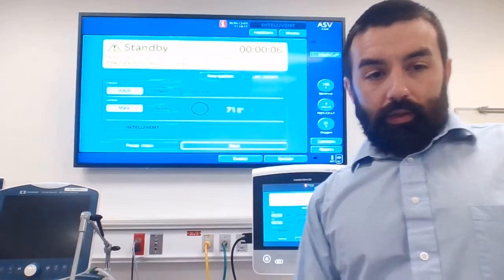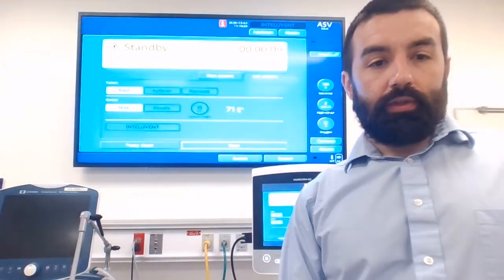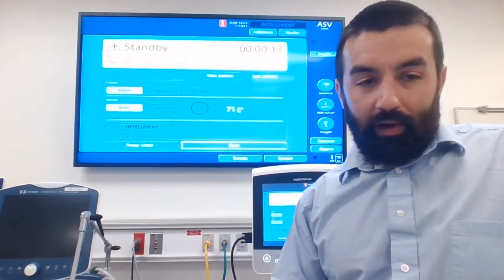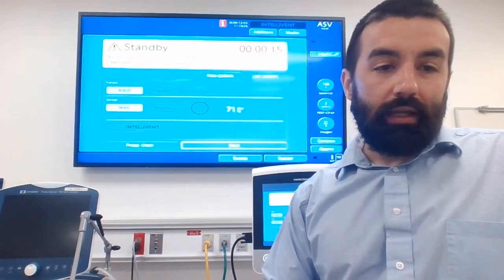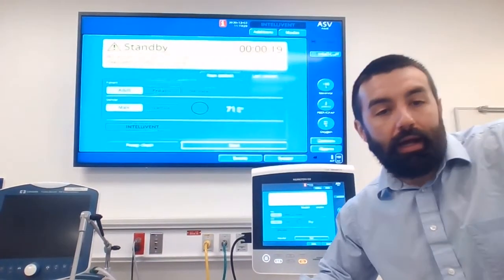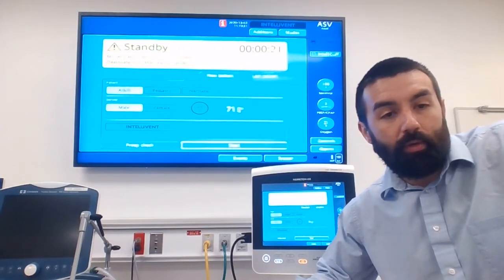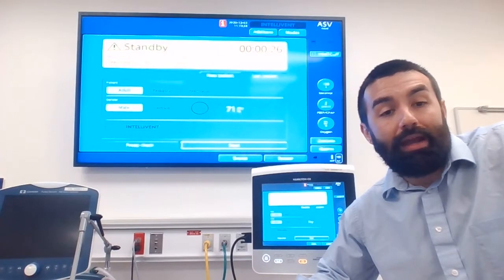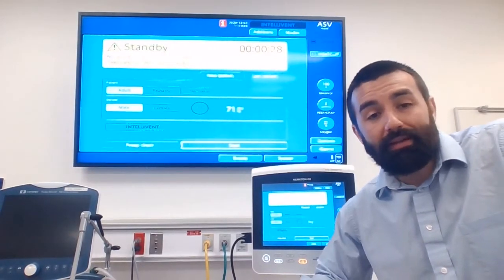Hey guys, so today I'm going to introduce to you volume support. So we talked about it a little bit. It's really like PRVC for a spontaneous breathing patient. It's important, even though we're not using it a whole lot on adults here locally. It is important to understand what volume support is if you're going to work more with kids, or to clearly understand how ASV works, because it uses volume support for a spontaneous breath.